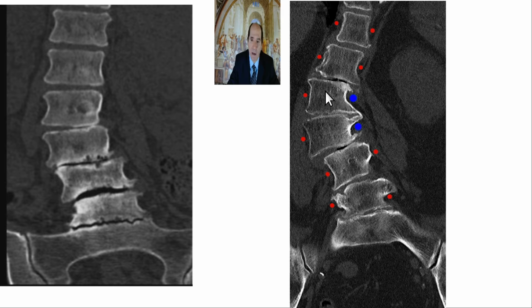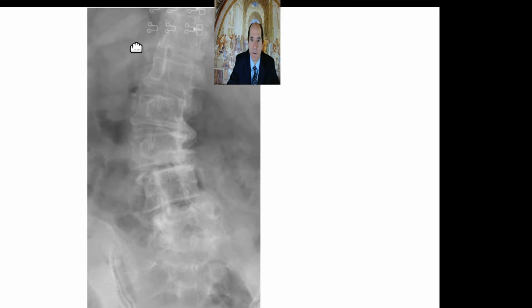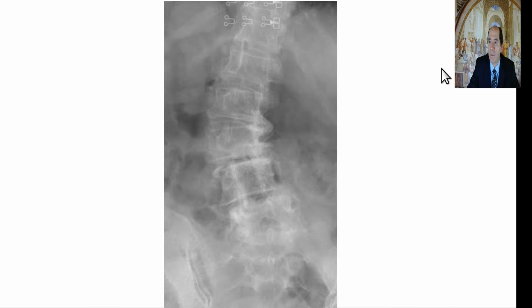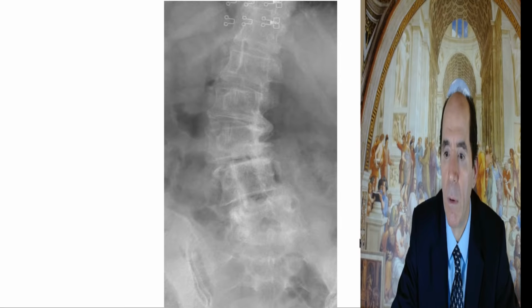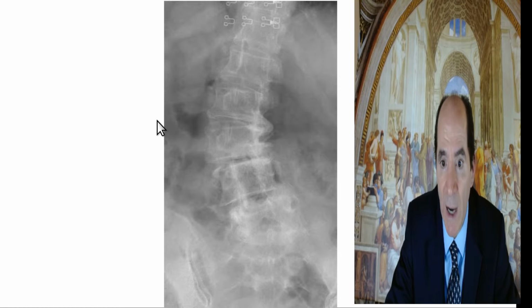Okay, so this is a lousy looking spine, typical in a 70-something or 80-something-year-old person. In a younger person, that would be much more accelerated disease. Here's just a plain film appearance of it. That last one was a CT scan. On a plain film, you can see there's gaseous disc degeneration in here. You can see asymmetric narrowing of the disc. It's more narrow on this side, the patient's left, than on the patient's right. Apex of the curvature is towards the patient's right.